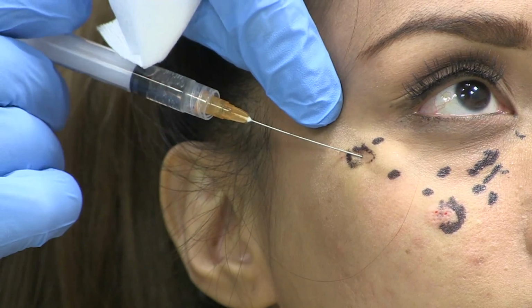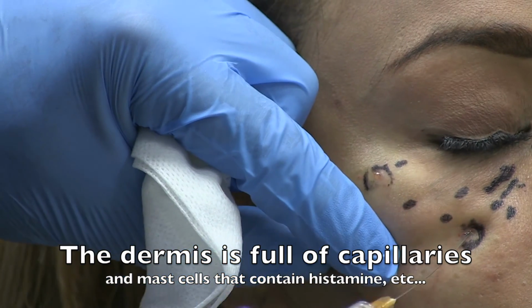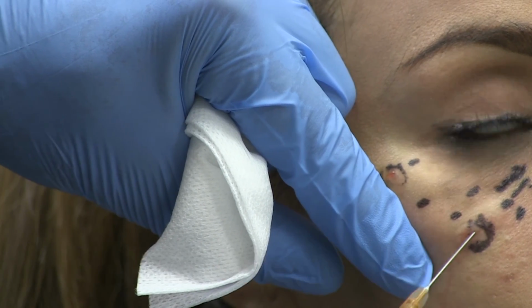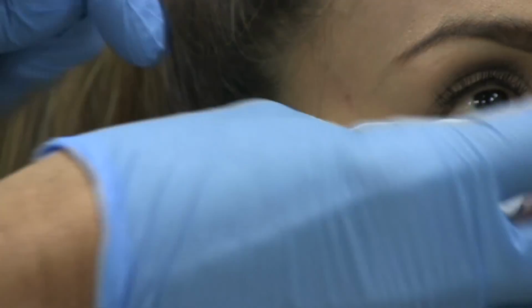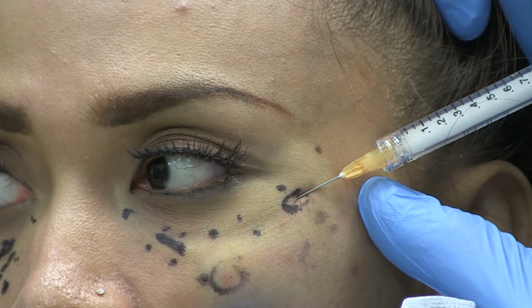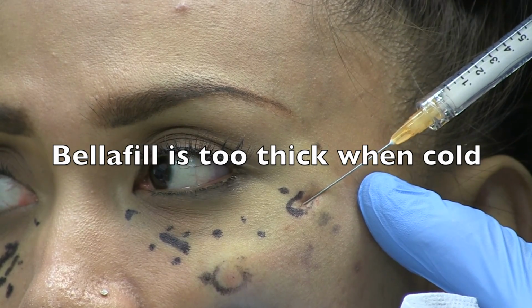You need to be careful to slip in gently just beneath the skin without rubbing against the skin, because this causes swelling and it can even cause delayed bruising. So usually enter 60 to 90 degrees to the skin, and then you quickly turn to whatever angle you need before you go too deep. Then pressure is applied again and wait another 5 to 10 minutes for the skin to turn white, so you know that it's unlikely to bruise when you inject, as white means the skin no longer has blood in that area.